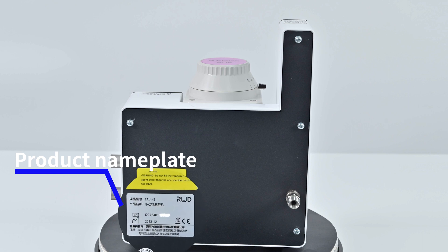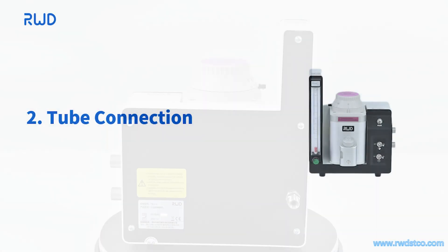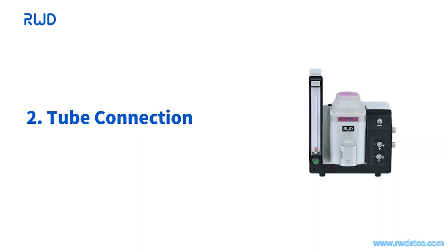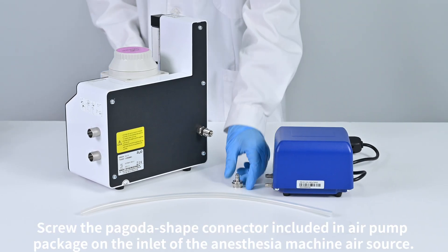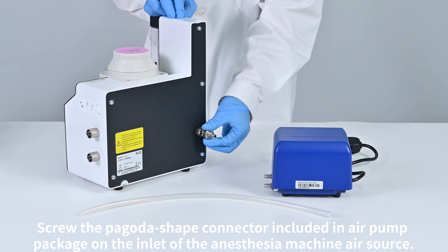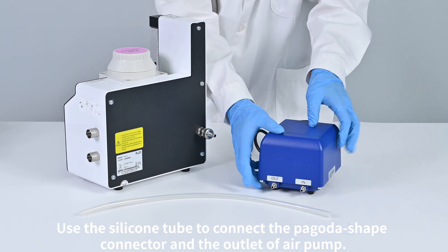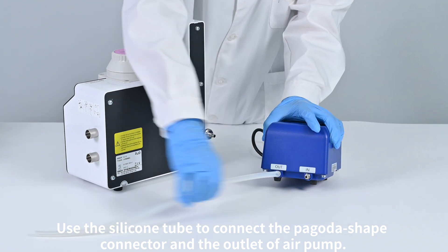Product nameplate. Air inlet. Air pump connection: screw the pagoda-shape connector included in the air pump package onto the inlet of the anesthesia machine air source. Use the silicone tube to connect the pagoda-shape connector and the outlet of the air pump.